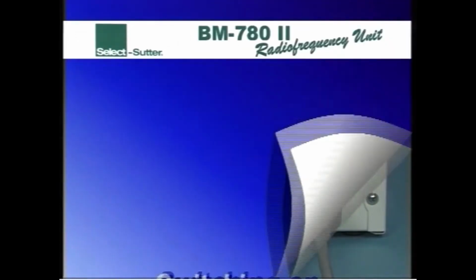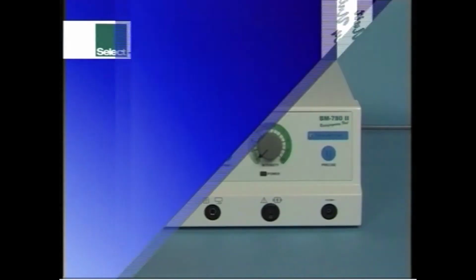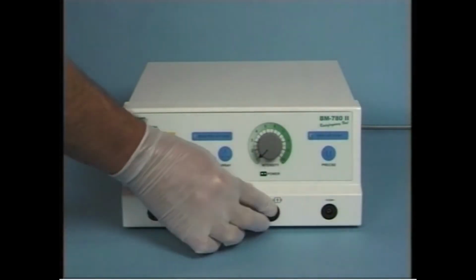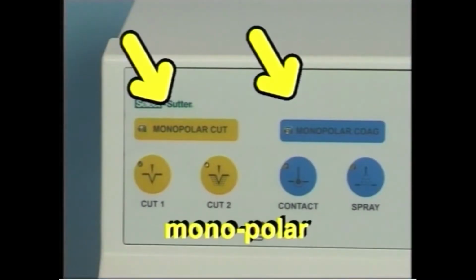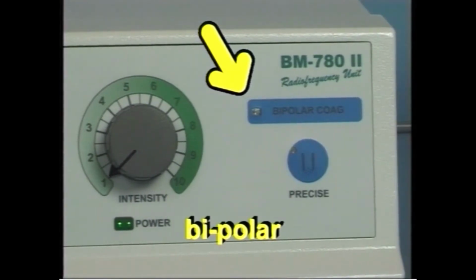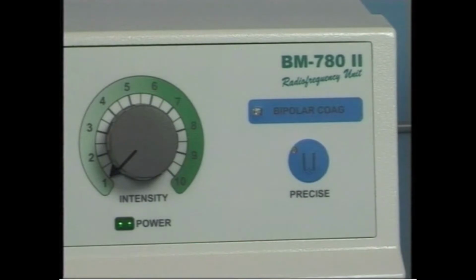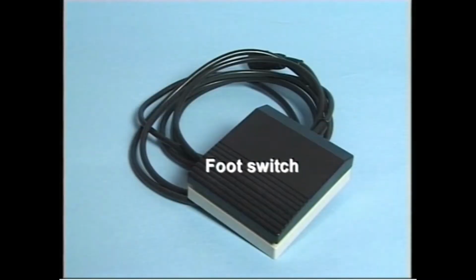Switching on the generator. Turn on the device by using the switch at the front. The RF generator BM-780 Mark II has a monopolar outlet and a bipolar outlet. The bipolar outlet can only be activated by foot switch. The monopolar outlet can be activated either by foot switch or by a hand switch located on the electrode pencil.